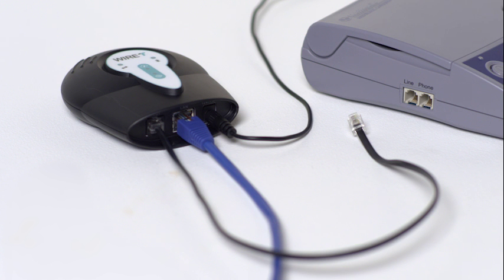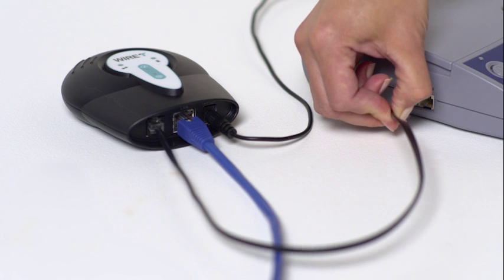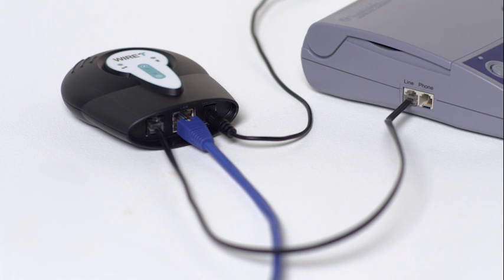Then, we'll connect your new internet accessory to your CareLink monitor using the short phone cable. Insert the end of the phone cable into any available phone jack on your CareLink monitor, making sure it snaps into place.